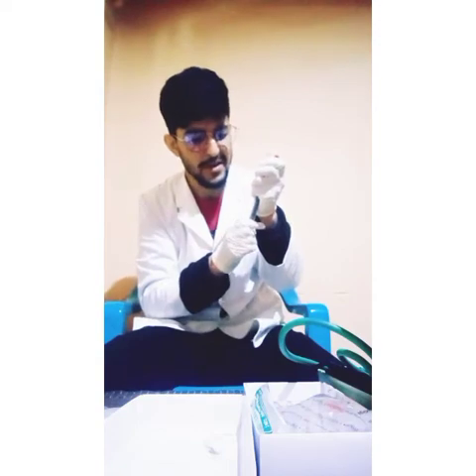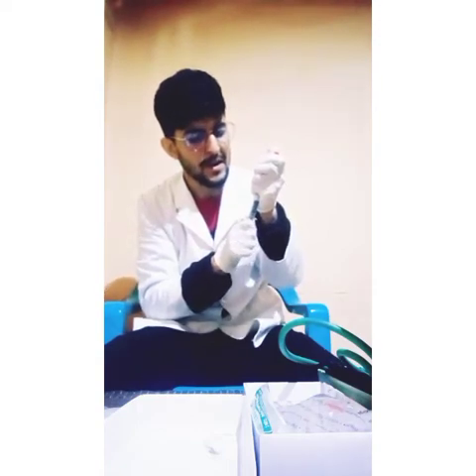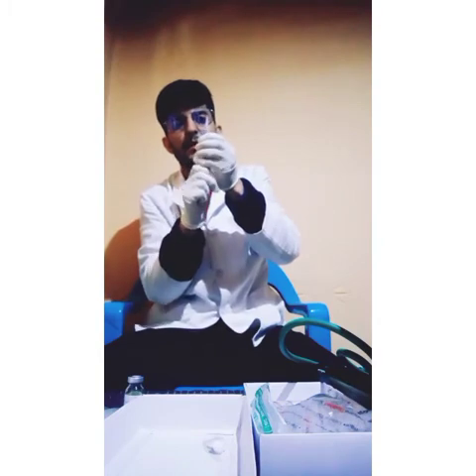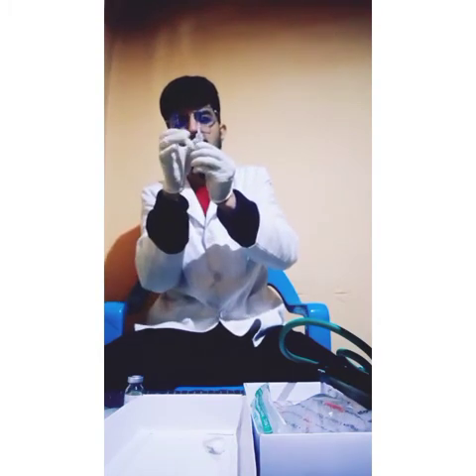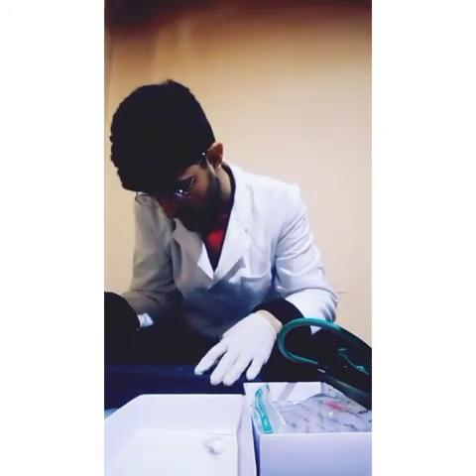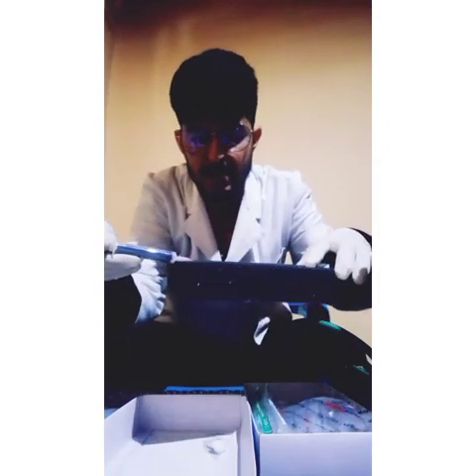We actually use a 25 gauge syringe and 25 gauge needle, and administer at an angle of 10 to 15 degrees. After getting the medicine, remove the air from it. Now we administer using the 2 finger technique. This is the dummy. This is where we administer, at the 10 to 15 degree angle, just like this.